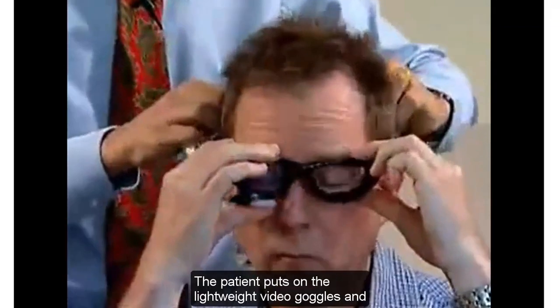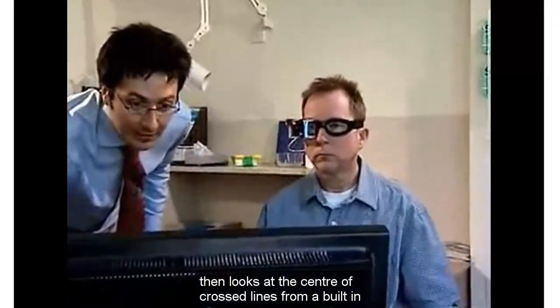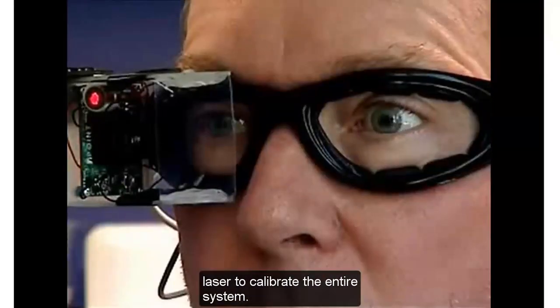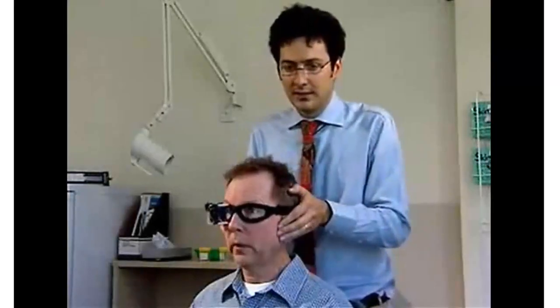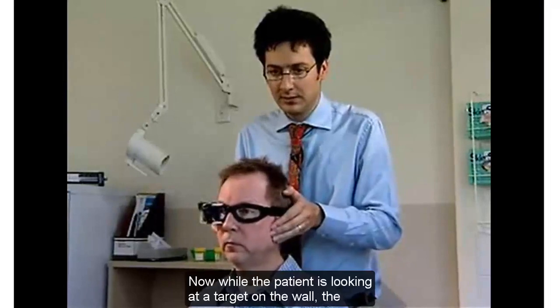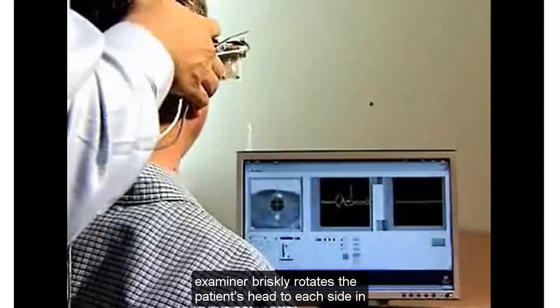The patient puts on the lightweight video goggles and then looks at the center of crossed lines from a built-in laser to calibrate the entire system. Now, while the patient is looking at a target on the wall, the examiner briskly rotates the patient's head to each side in random order.